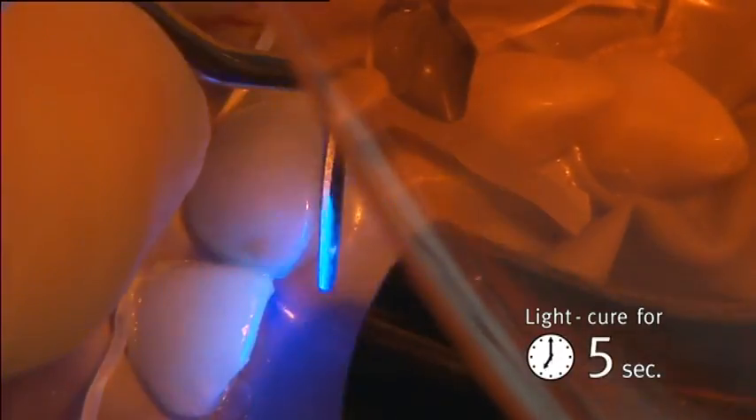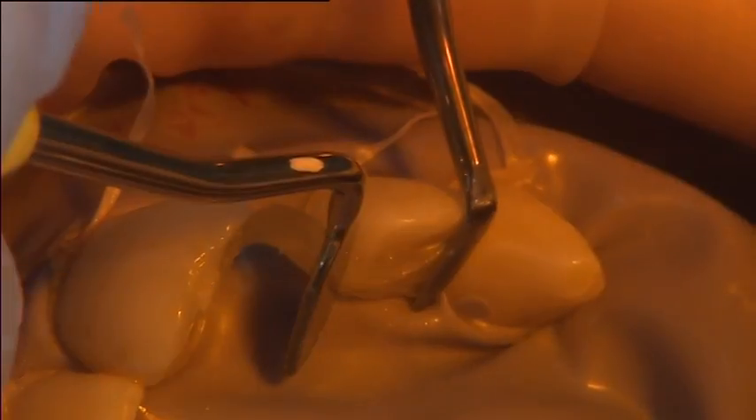The fibre was then light cured for 5 seconds from one end, while the wide tip of the stick stepper instrument protected the rest of the fibre bundle from the curing light.